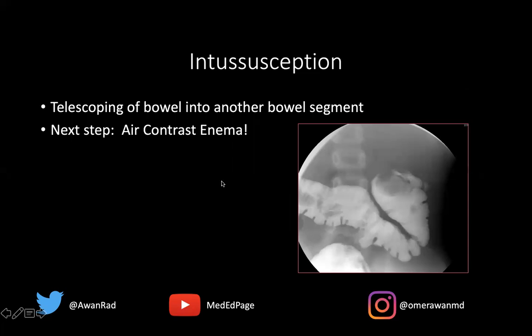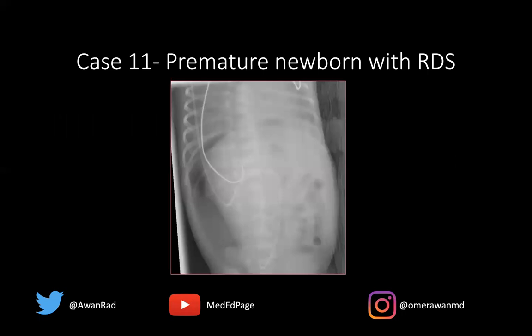And this is what you would do. Now, most intussusceptions are ileocolic, but sometimes you want to look for a lead point, like a Meckel's diverticulum, lymphoma, something like that. Moving on to the next case.